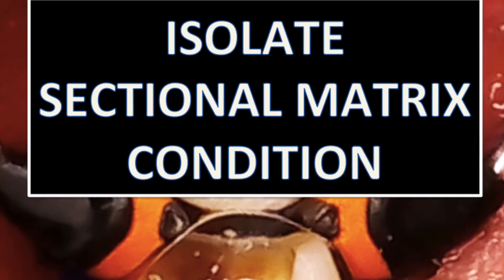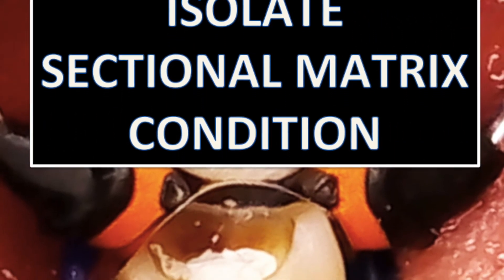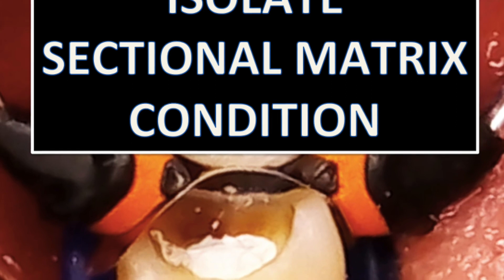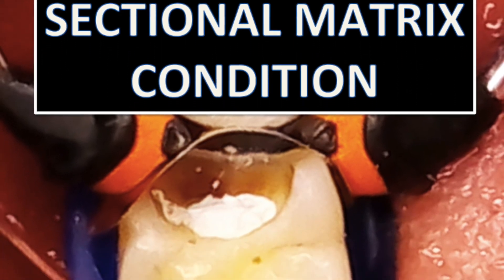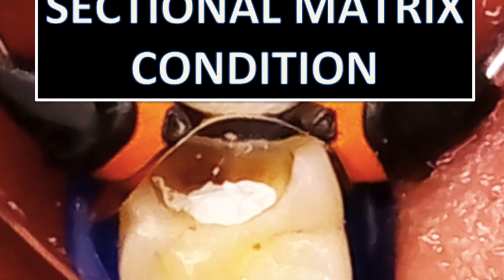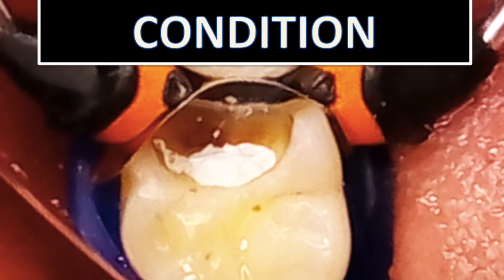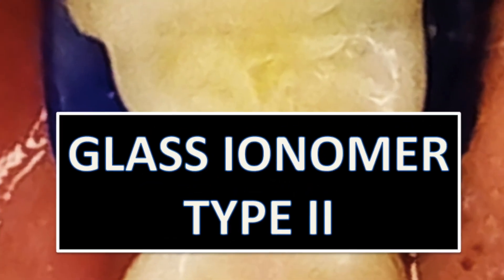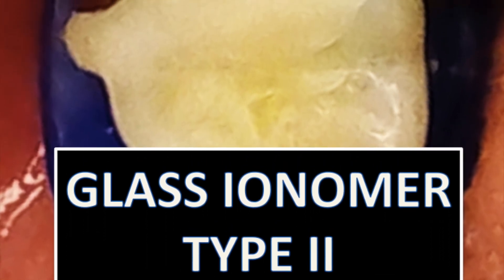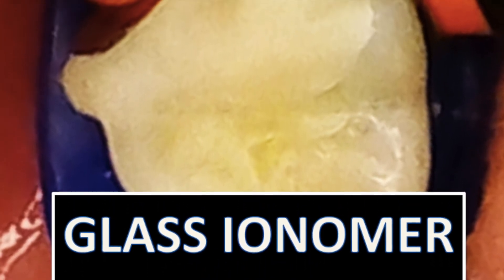So after tooth preparation and placing teflon tape inside the pulp chamber, isolate the tooth using any sectional matrix band of your choice, then condition the tooth, after which you can inject or pack glass ionomer type 2 into the cavity, light-cure the glass ionomer, and then remove the band.